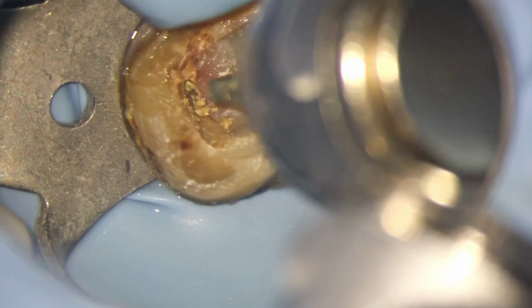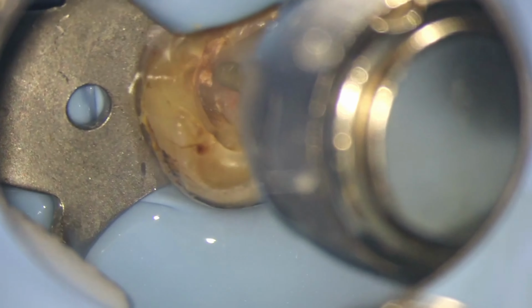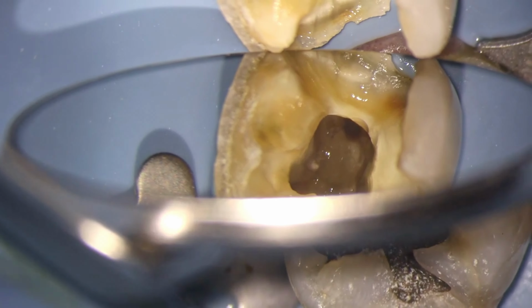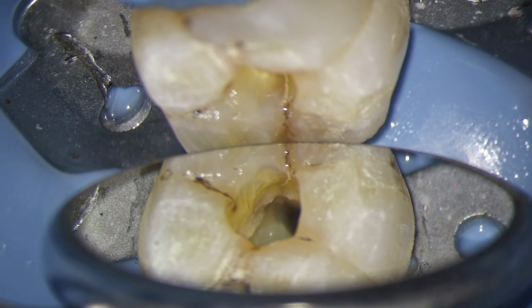So what we do in root canal treatments is, first things first, we have to take out your existing restoration, take out the decay, and have a look at how much healthy tooth structure is available to us. That's number one. Number two, see if there are any signs of cracks or fractures, and is this tooth actually salvageable? Is this restorable? Is this worth putting back into function in your mouth again? So as I said, first things first, restorability assessment. We take out all this stuff and clean that up really well.